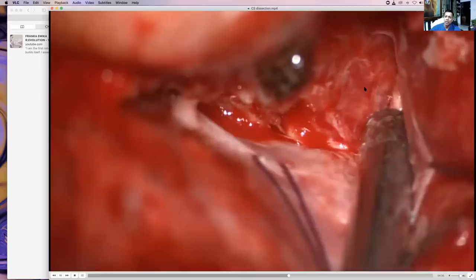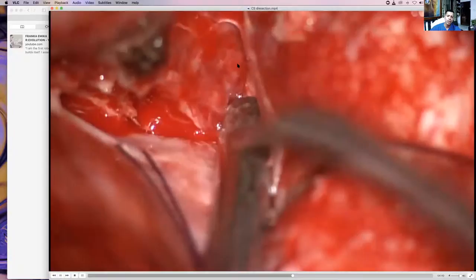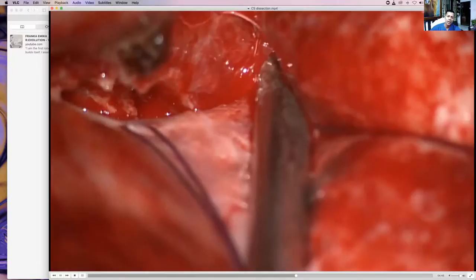So this is called axial unlocking. So under very high zoom, I'm taking off this temporal lobe. I'm doing a pericavernous dissection, it's not transcavernous. So what I'm doing is, see the frontal lobe? The temporal lobe would have been here like that.